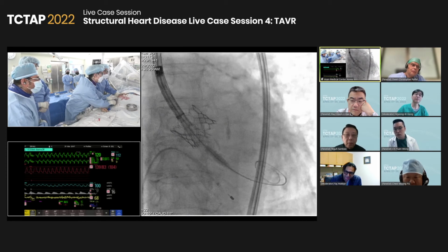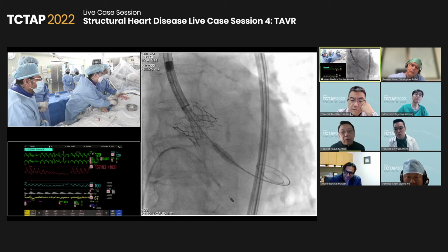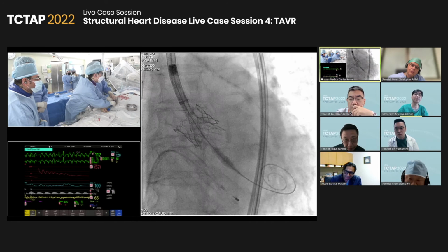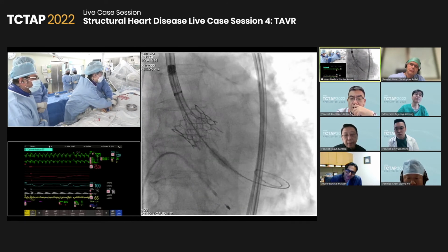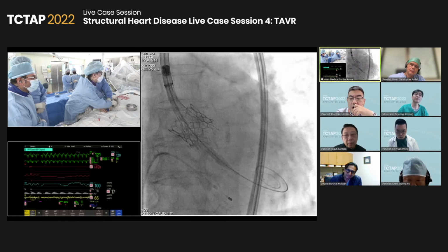Okay, release. Are you taking care of the commissural alignment during deployment? Come on, raise it, keep raising it. Yes, I think so. He did it. A little more, up. Raise the pressure more, until the blood pressure comes up. Okay, a little more, that's good.